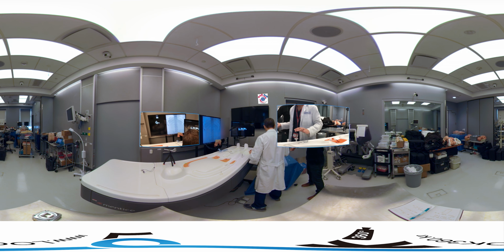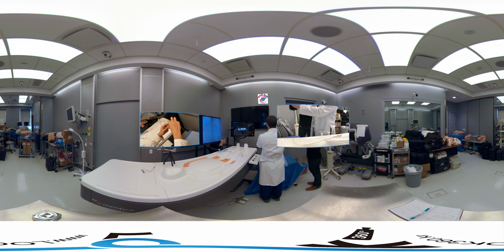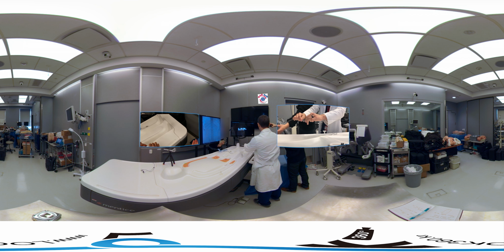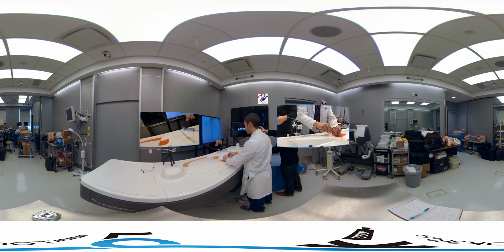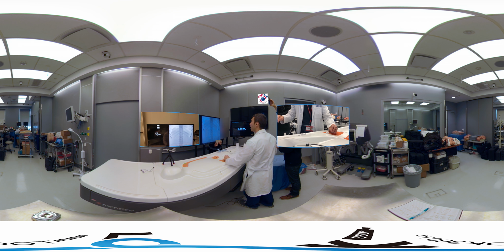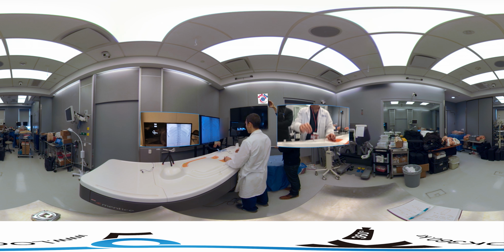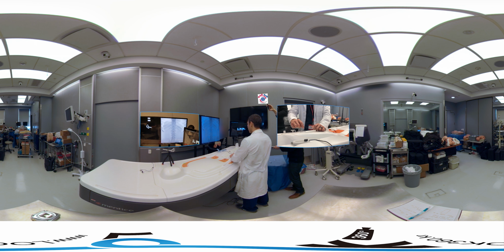Next, over the wire, we're going to load our sheath, as I mentioned. And the sheath will come over the wire, and then we'll run the sheath up the wire. The machine should recognize it, and when it does, it'll light up, and then we'll run it over the wire up to the level of maybe L4, so that we can see some of the inflow from the other side, as well as get a nice picture of the IVC. So now we can remove the wire.